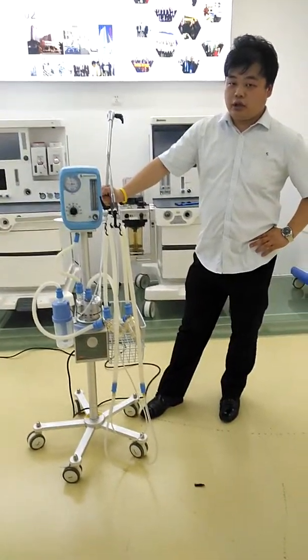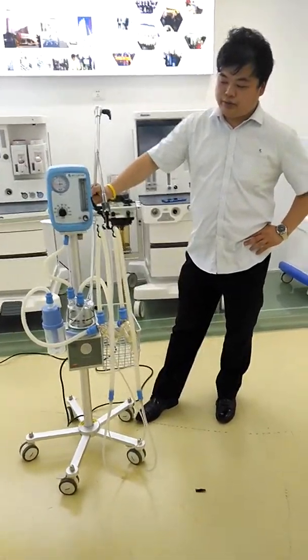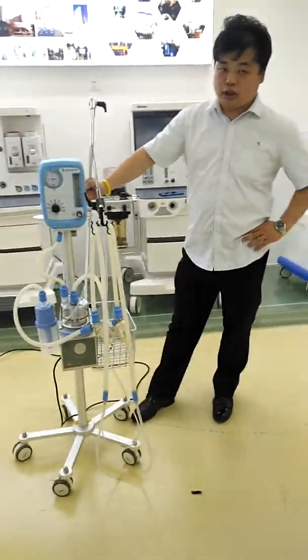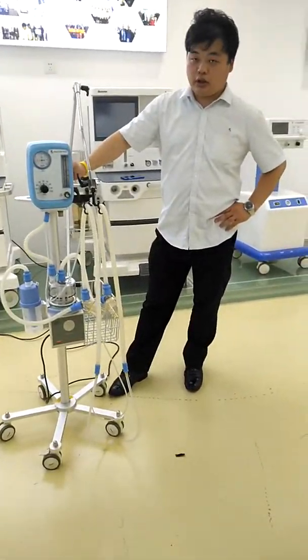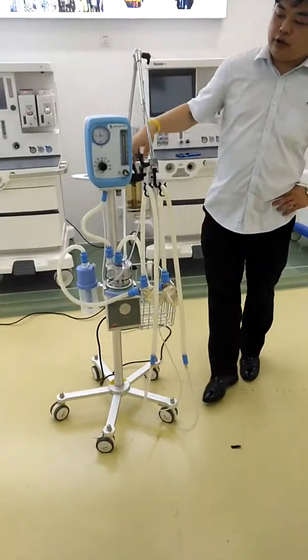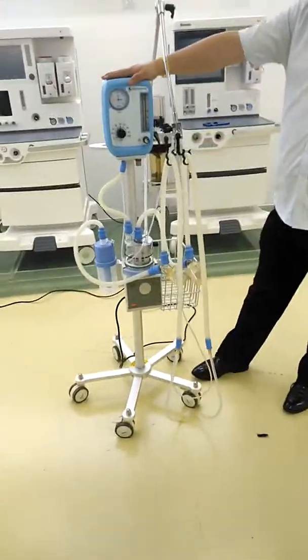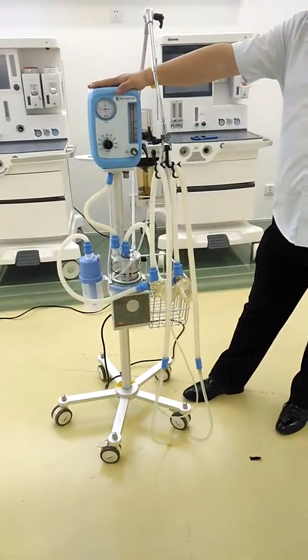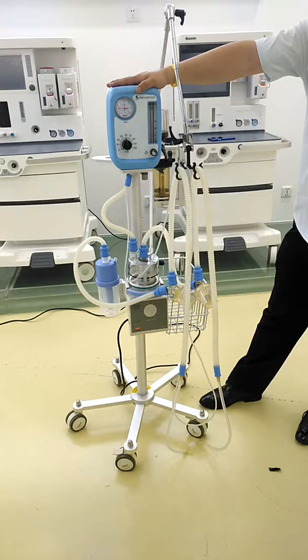This is our NAF 200B CPAP system, also called the continuous positive airway pressure system. This machine is mainly used for babies who are premature and have weak lung function.